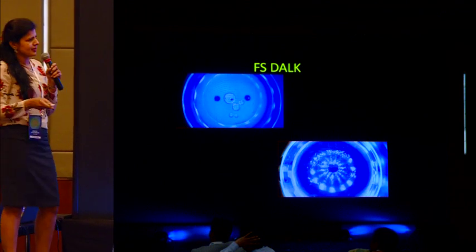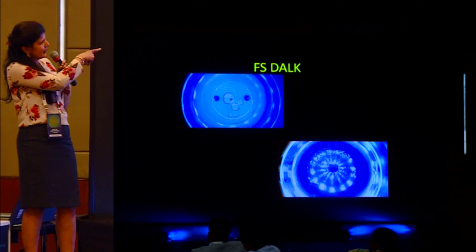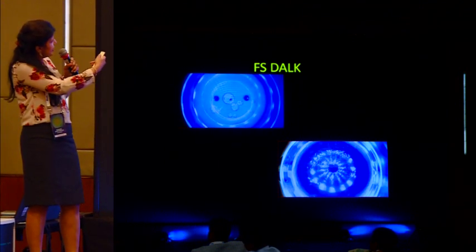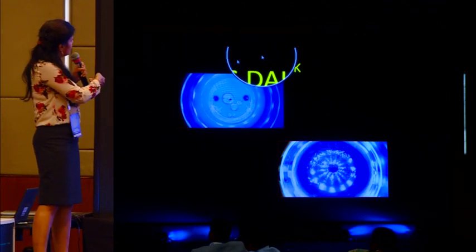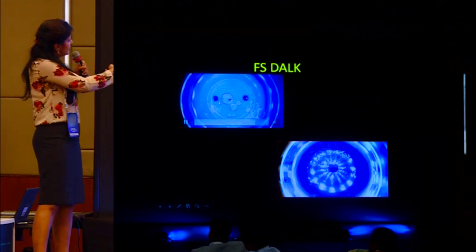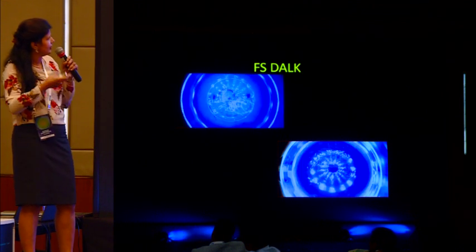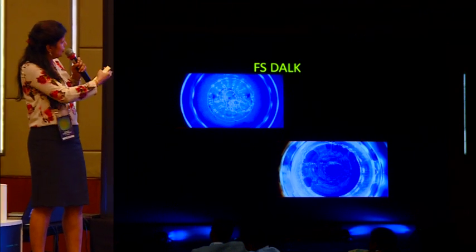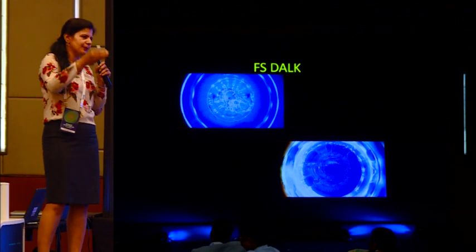Now another situation is when you use it for keratoplasty. That is with the donor cornea in the artificial anterior chamber, and you can see how the laser cuts. You can see those small bubbles over there. I'm scared it will freeze again, but nevertheless, those small bubbles in the anterior chamber show that the cut has already been made, and the other bubbles you see are underneath the PI. So that's a full thickness cornea cut that you're taking. Though the outer and the inner diameters may vary, you can keep it the same as well.